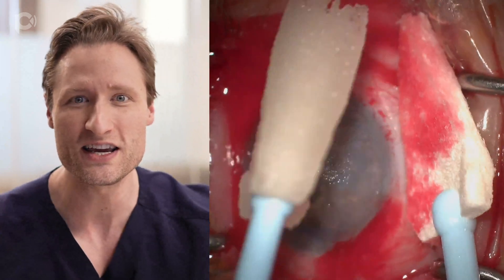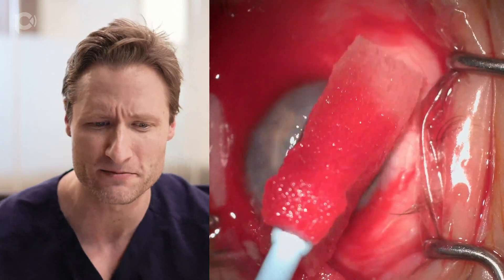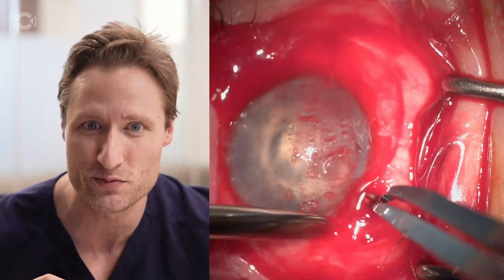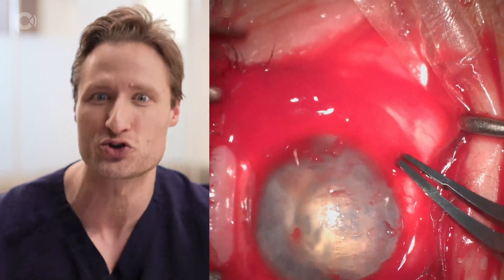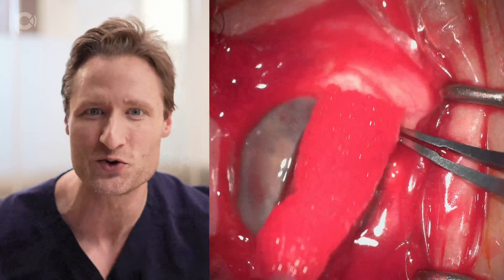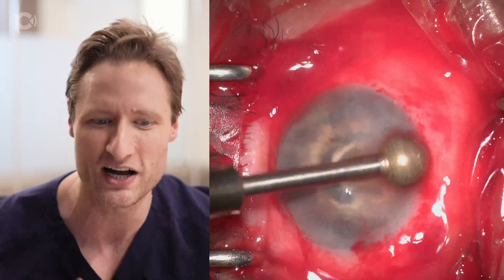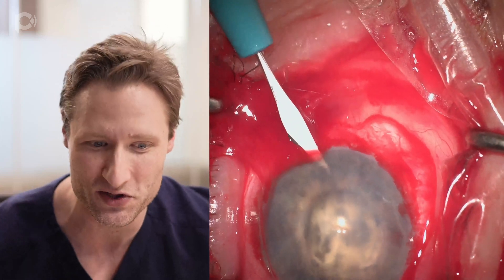We're starting with an EDTA chelation of the band keratopathy present in her cornea. The way I like to do this now is with a K2 EDTA solution — it comes in the purple top tubes. You put that on top of a Wexel sponge and rub it into the anterior stroma after debriding the epithelium, then pick at the residue remnants in the anterior stroma with a Tooke knife and then a diamond burr polisher. After some period of time, we gradually remove enough of the calcium deposit so we can get started with the case.